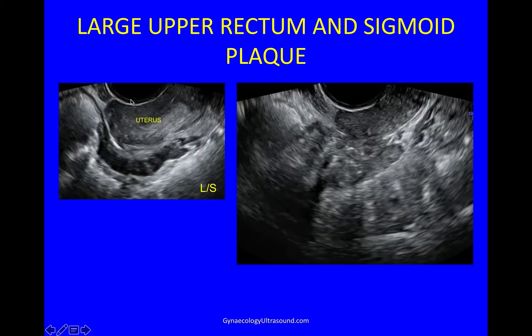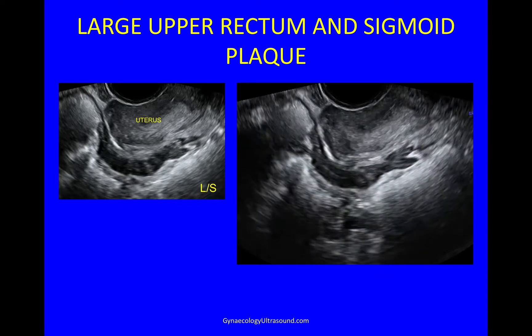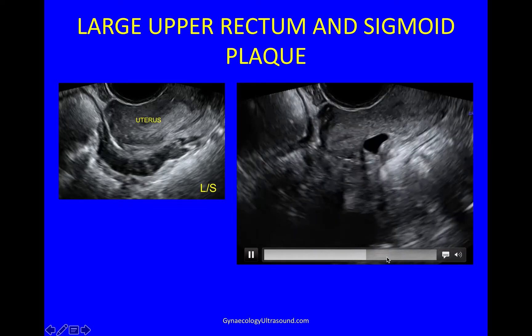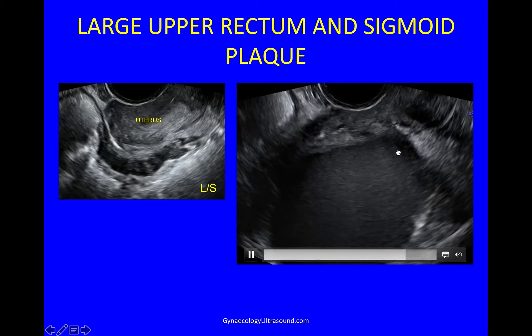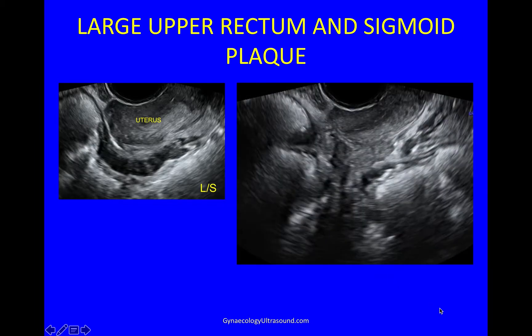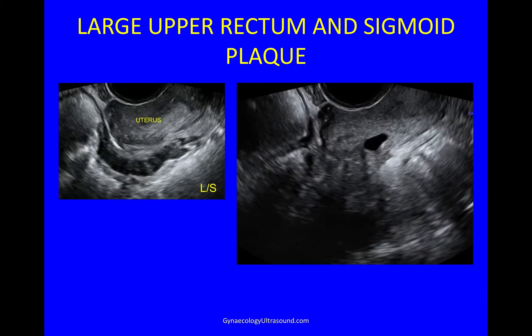Here there's a uterus with a very large plaque of endometriosis affecting the upper rectum and the sigmoid. There's the uterus and there comes this really thick dark plaque of DIE, and the huge ovarian endometrioma are all attached to one another. So this is upper rectum and sigmoid.